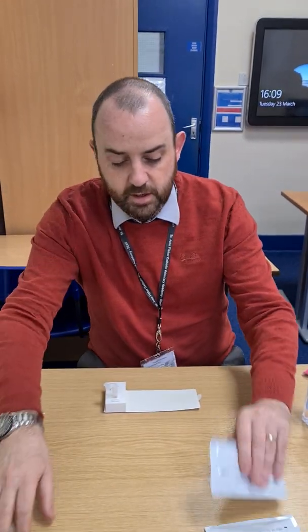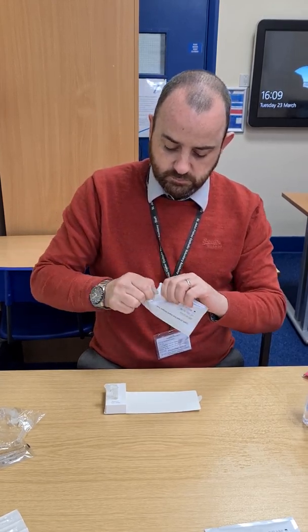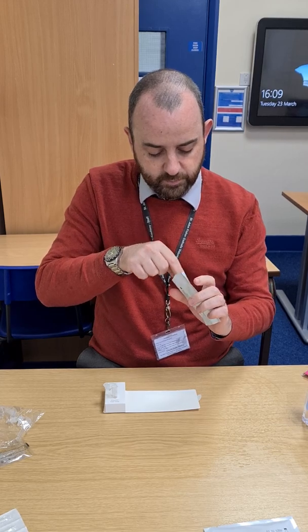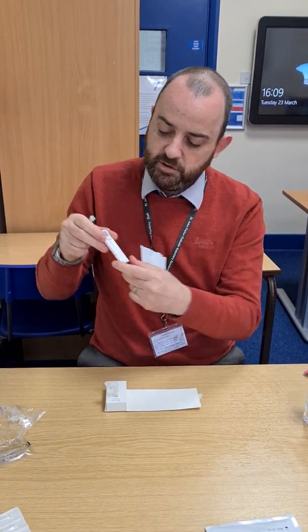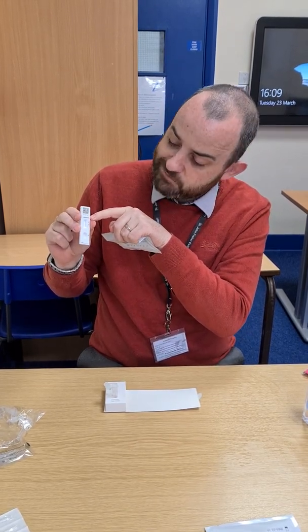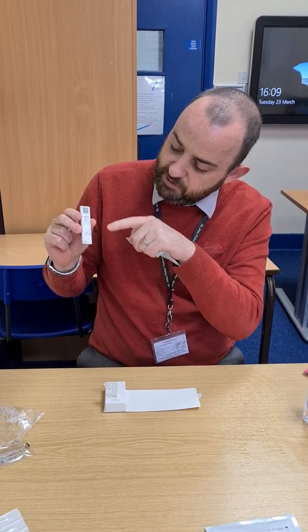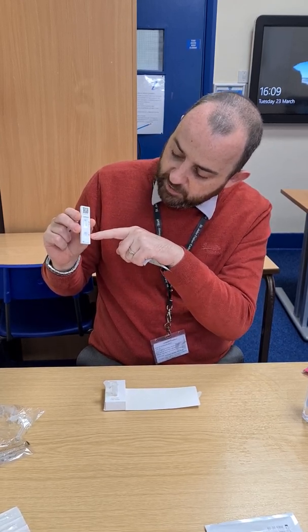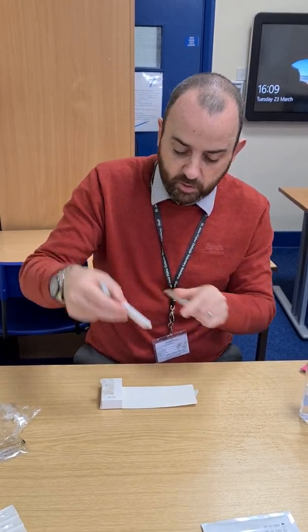Take one of the lateral flow tests and open the packet. You can see the back and the front of the lateral flow test. It has a code that you'll need to register the test once completed. It has the area where you read the results, and the area marked S is the well where you'll drop the liquid after completing the swab.